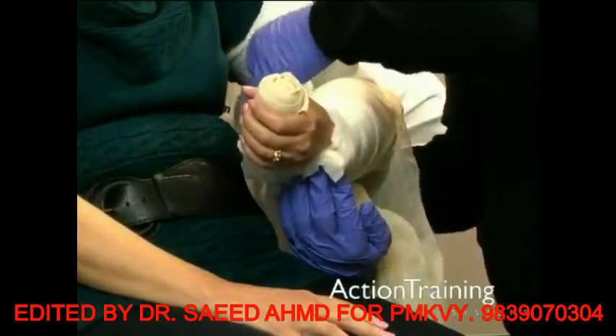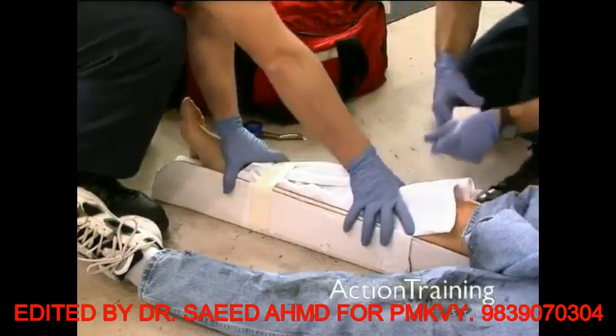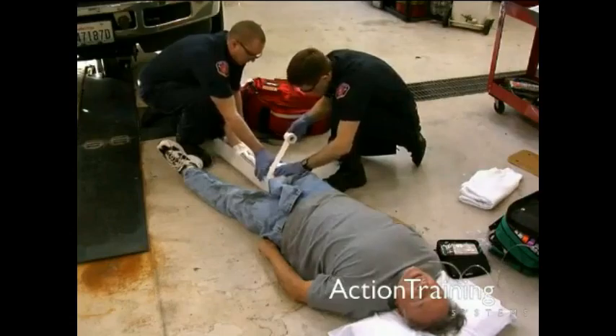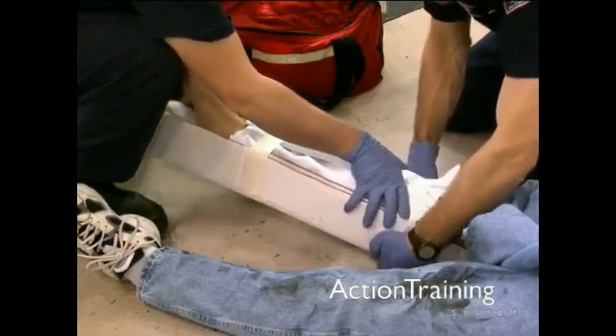A roll of bandage in the hand can help support this position. Continue to hold manual stabilization. Secure the splint to the extremity by immobilizing the joints above and below the injury, and elsewhere as indicated by the manufacturer's directions or per local protocols.